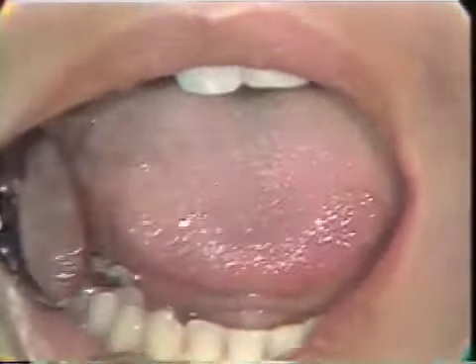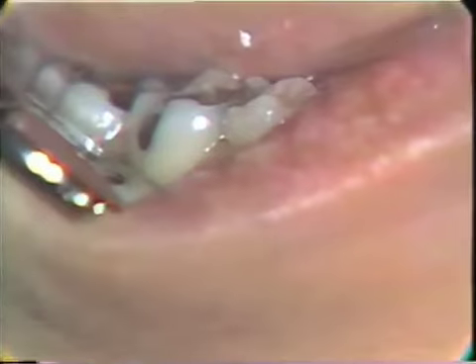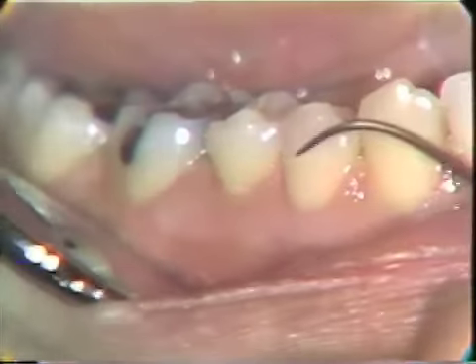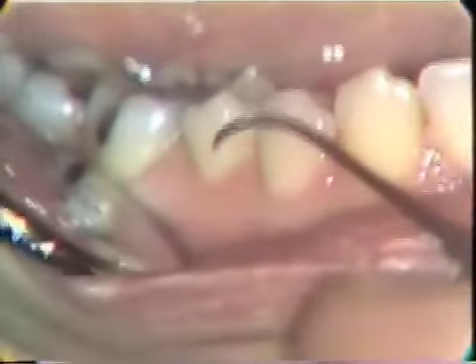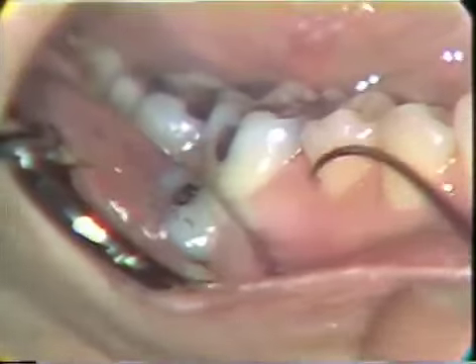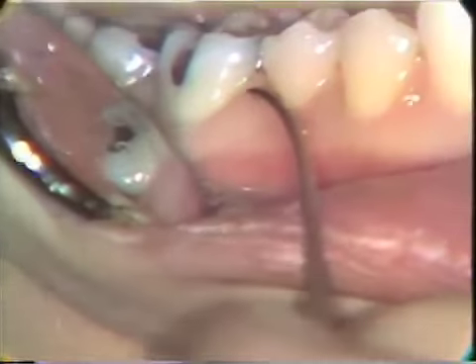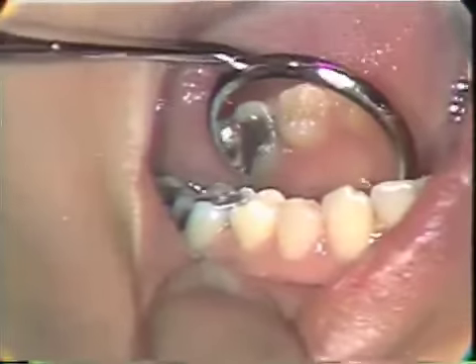Now to the lower right quadrant. Let's look at tooth number 28. We'll check labial and occlusal and lingual as we go around. Number 29 had a question mark, and if we check the labial, we find it right here on the labial cervical. A break in the enamel, and it should be restored. So that resolves that question. We can look at the occlusal and the lingual as we go.